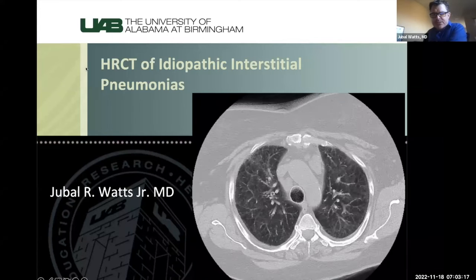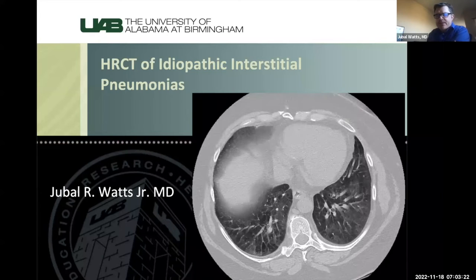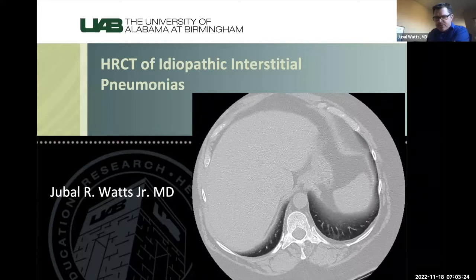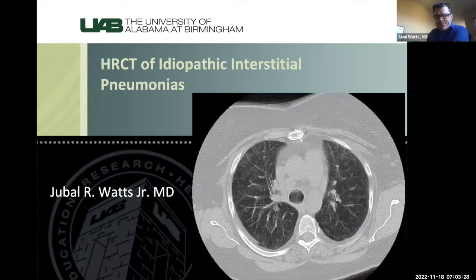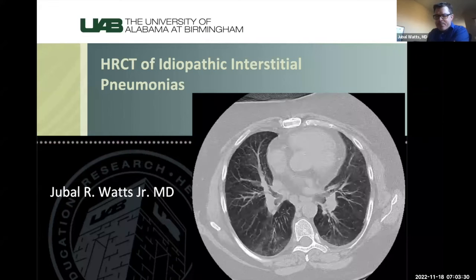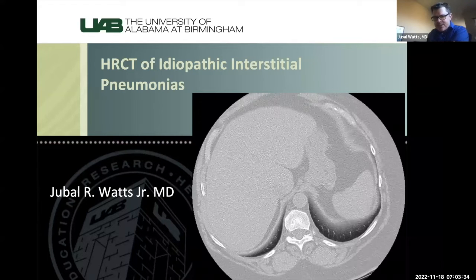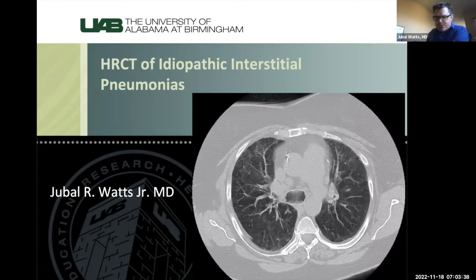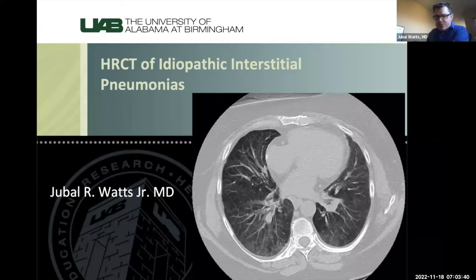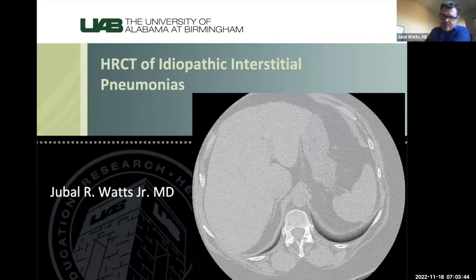Great. Thank you, Dr. Perchik. So my topic is going to be the high-resolution CT of idiopathic interstitial pneumonias. So dealing mainly with interstitial lung disease, which is sometimes not the most popular topic, but it is important because it's becoming increasingly recognized, and there's prognostic significance and some treatment options. So it's good to be able to recognize what the different types are and how to kind of triage the best appropriate management.